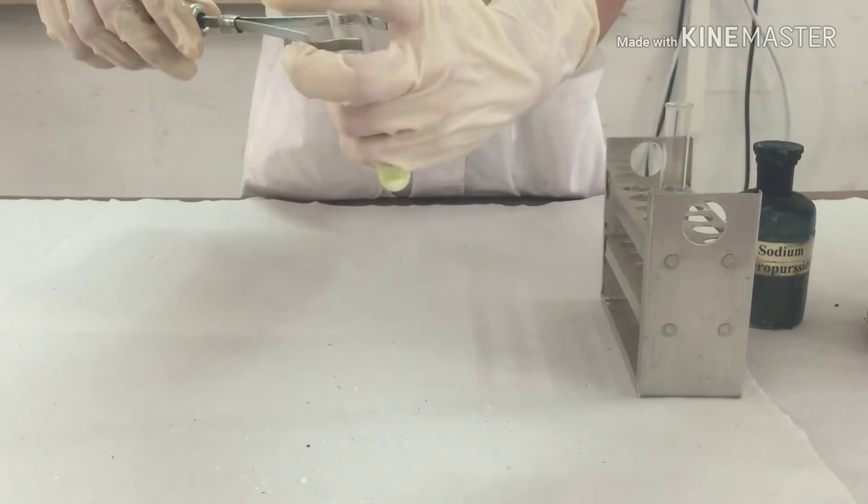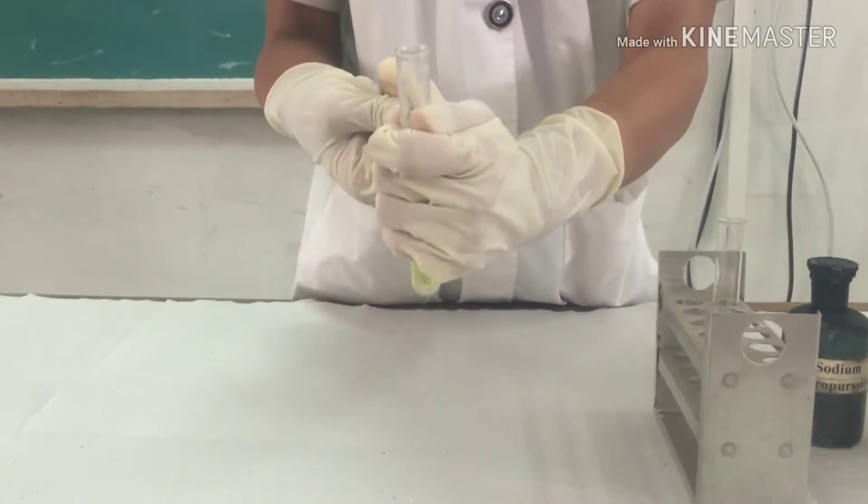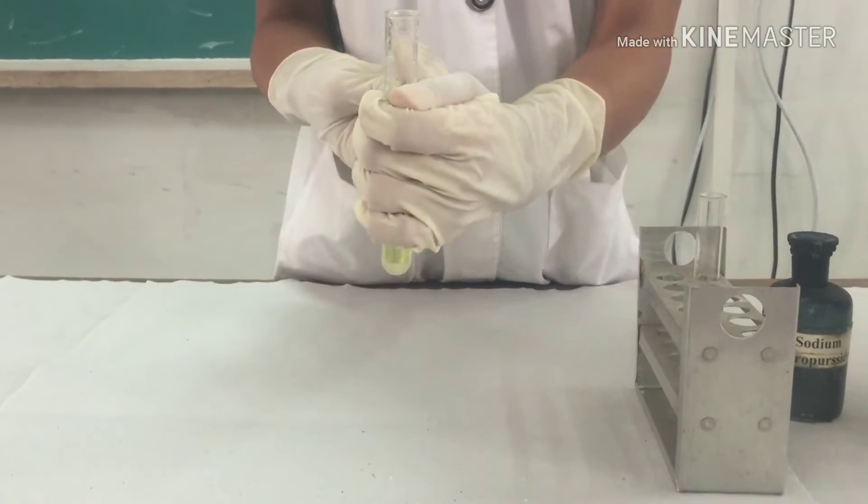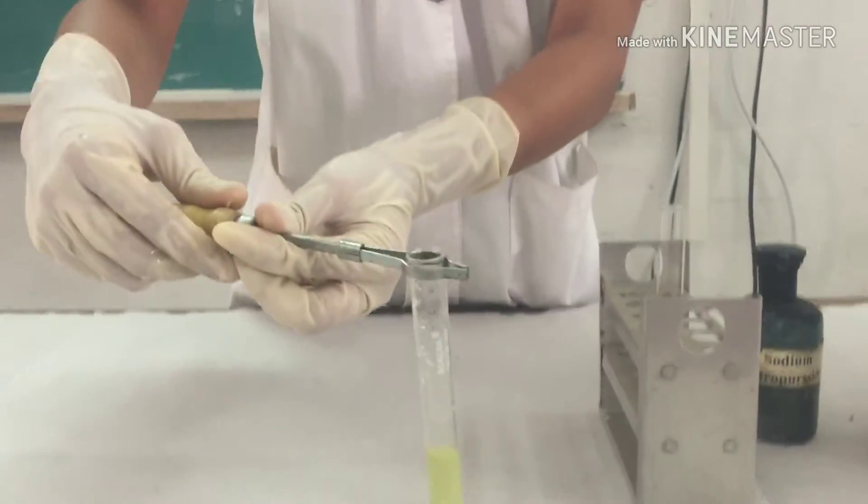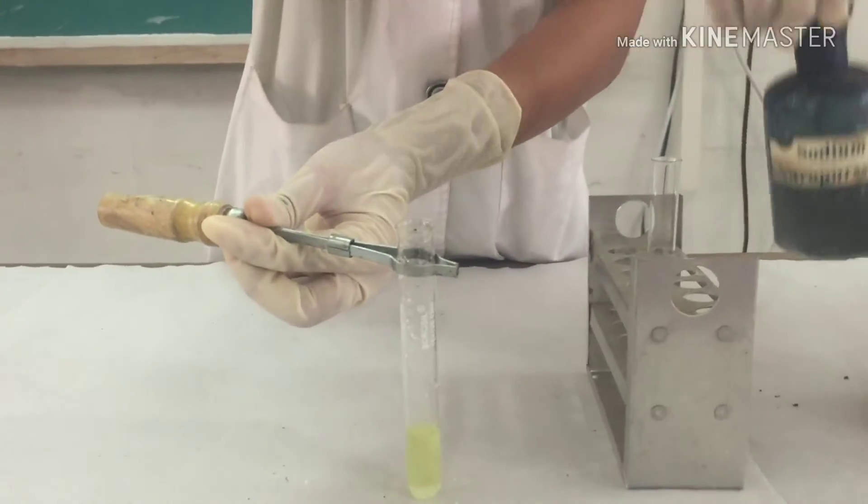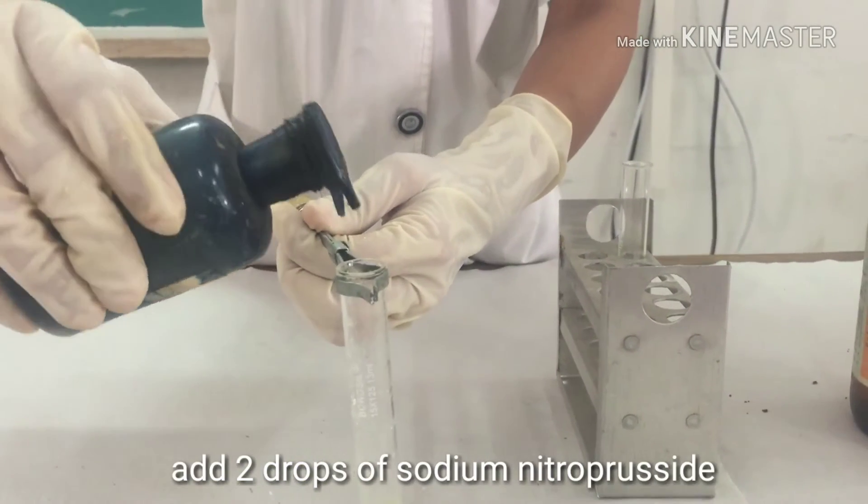Now hold the test tube firmly with a test tube holder. To this add 2 drops of sodium nitroprusside.